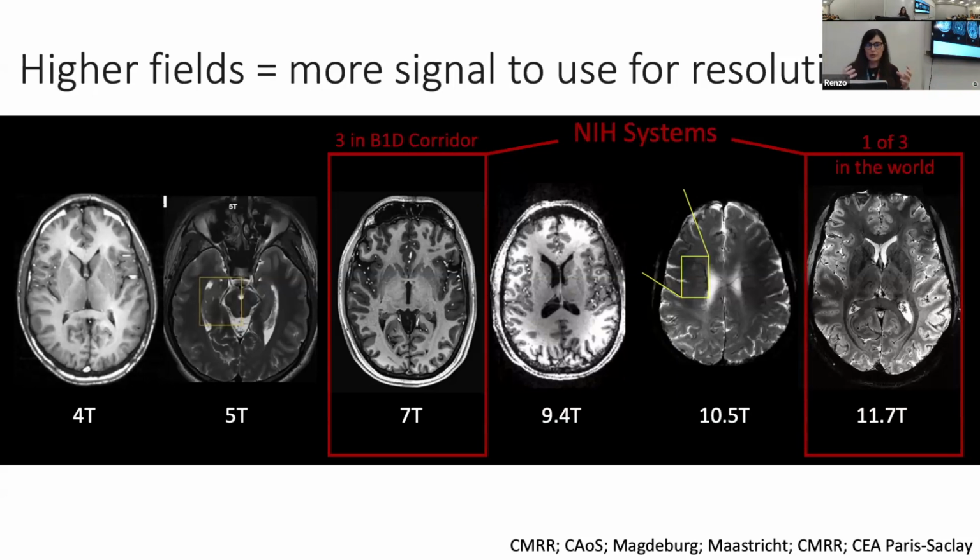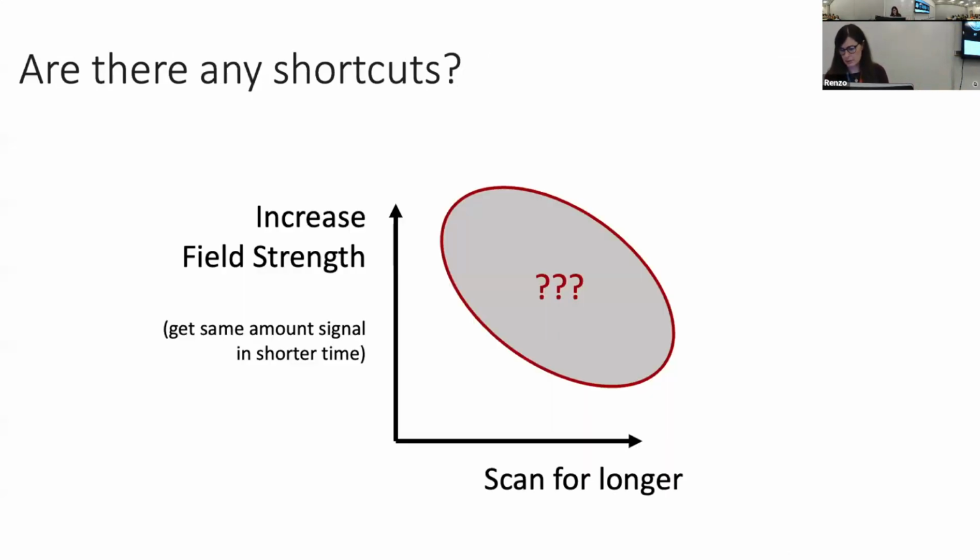So you have these really far ends where the technical challenges are extreme, but they have some really great payoffs if you can get there. And at the same time, we also have some scanners that are basically compromises. They really have great things about their signal amplitudes and what you can do on them, but you can also build them and engineer them and manufacture them, etc. So just to give you an idea of where we sit.